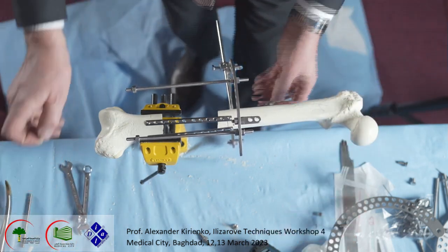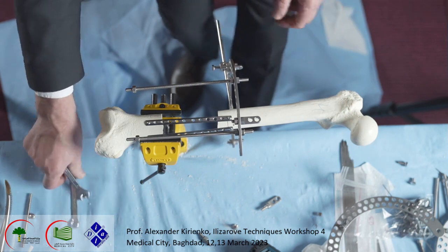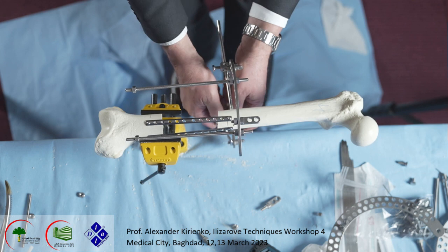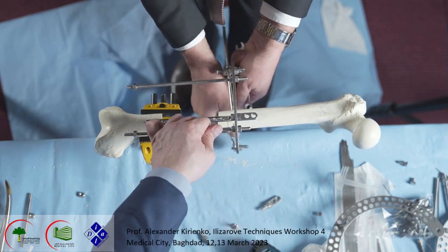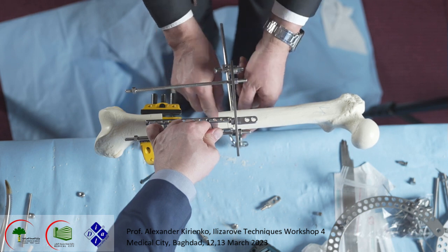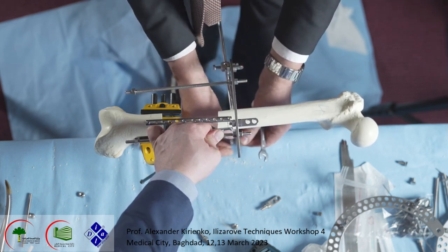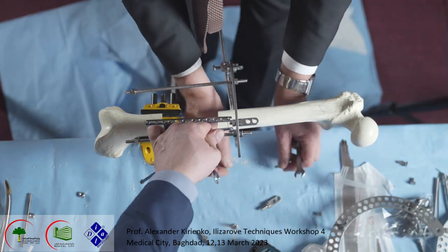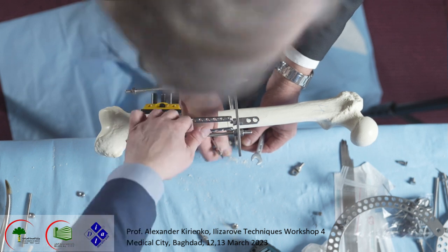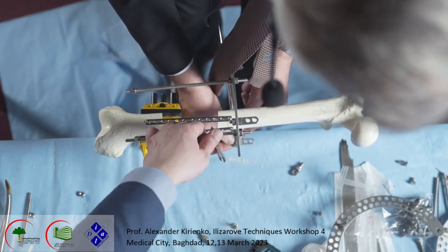Another one I put posteriorly. Two holes, male. Two holes. Yes, I put, yes.